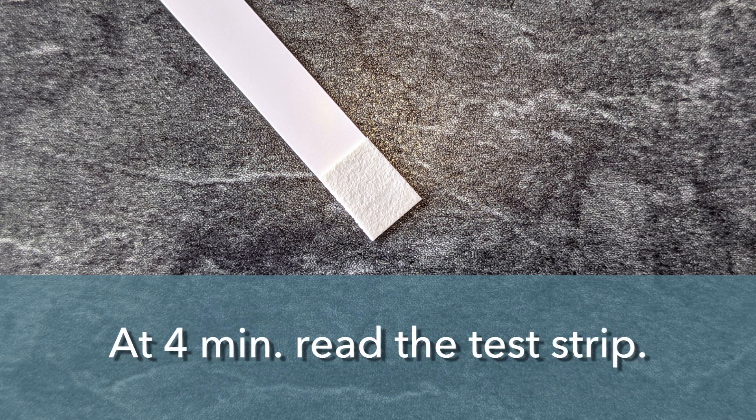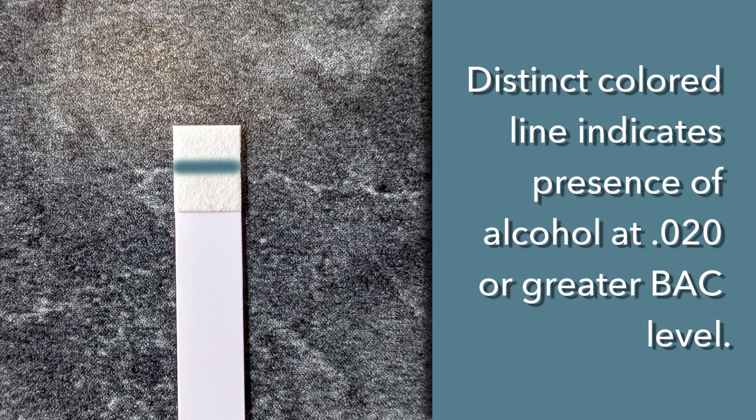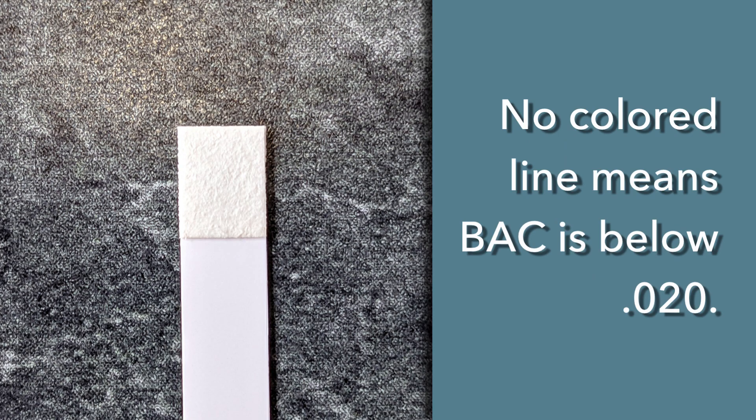At the end of 4 minutes, read the test strip by looking for the presence or absence of a distinct colored line. Do not read the test strip after 5 minutes. A distinct colored line on the test strip indicates the presence of alcohol at the .020 or greater BAC level, which, by DOT standards, is considered to be a positive screening test result.